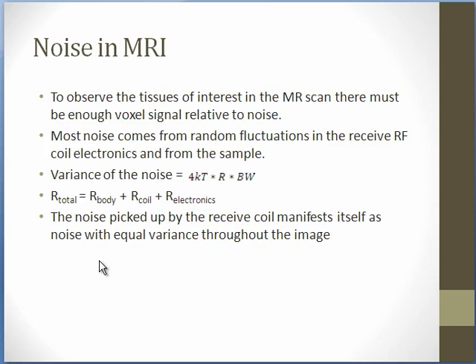And when we do that, the mathematics of the discrete Fourier transform, or the DFT, results in the noise, well, not just the math, but obviously the physics of it as well. That result, when we're going from the signal domain to the image domain, is that the noise gets spread throughout the entire image.